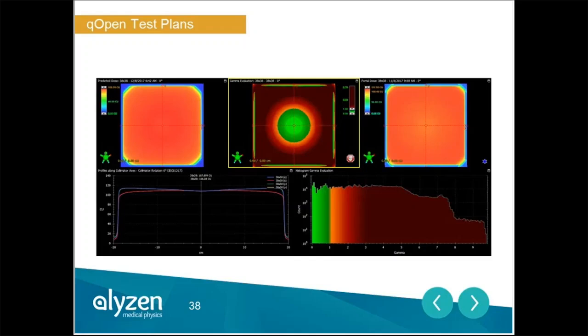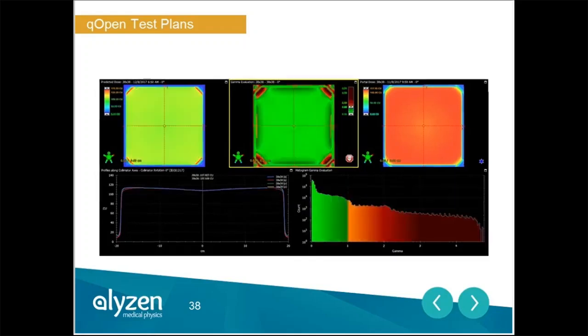That correction is used from these two images, and once I get that correction and apply it to my intensity profile and recalculate the model, this is what we get. What's really interesting is now we've got this full, really large field of view that's usable.